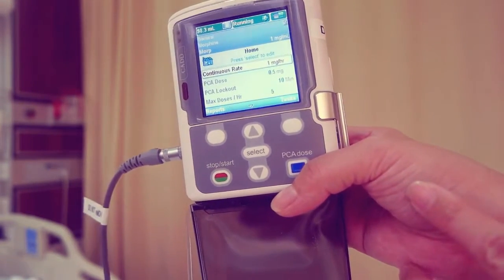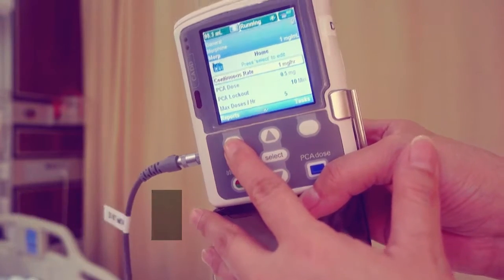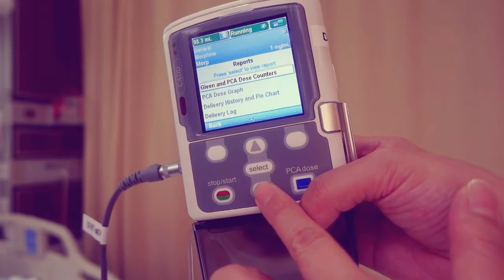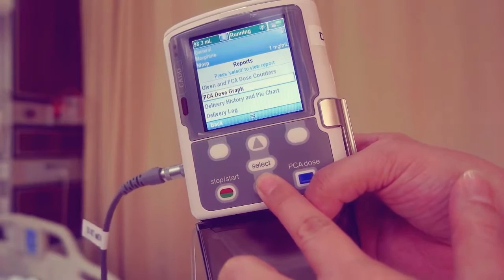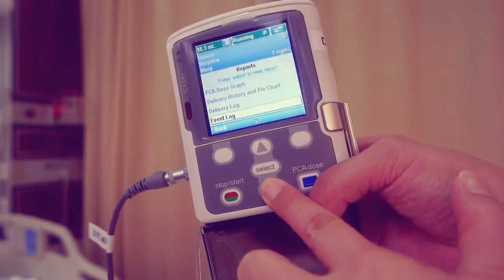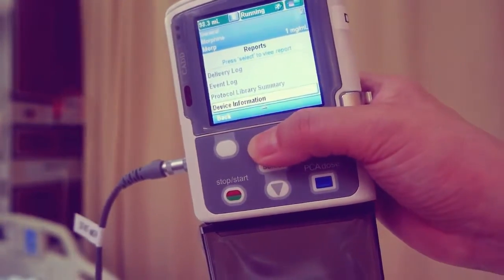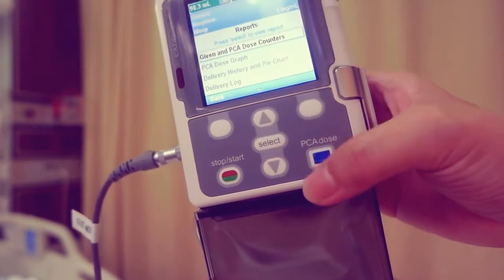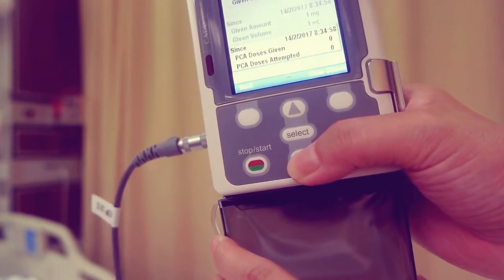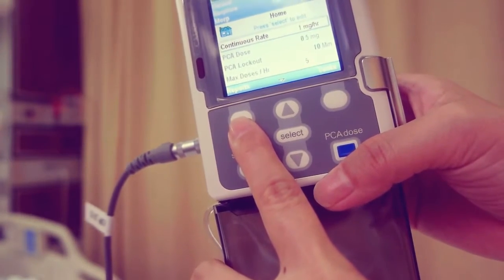Reports should be cleared in accordance with institution policy. The pump may be running or stopped to view reports. From the home screen, press reports. Scroll up or down to the desired report and press select. To clear reports, highlight given and PCA dose counters. Press select. Choose clear given to clear total given and scroll down to press clear doses. Press back to return to the reports menu, then press back again to return to the home screen.